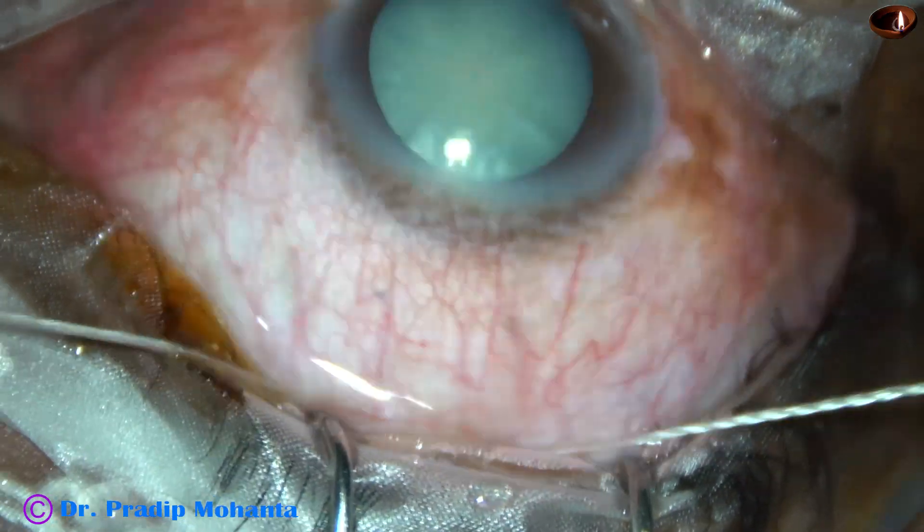Viscoelastic is injected to fill the AC and the capsular bag. In this case, we are going to implant a PMMA 6 mm optic intraocular lens, because we already have a large wound. The leading haptic goes into the capsular bag, and the trailing haptic is placed in the capsular bag.